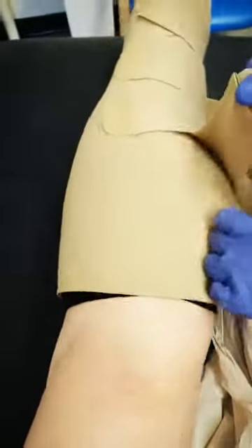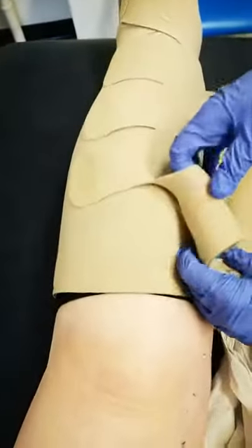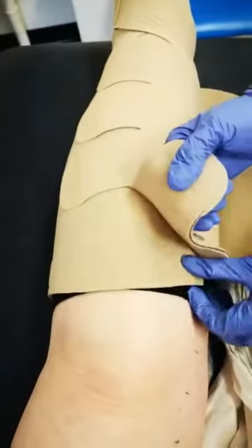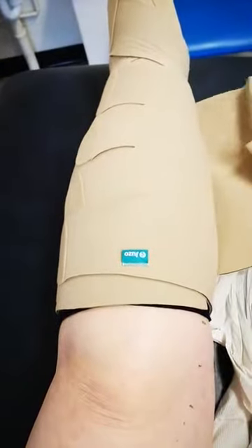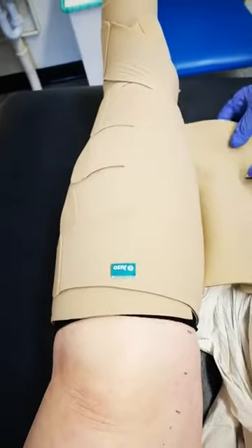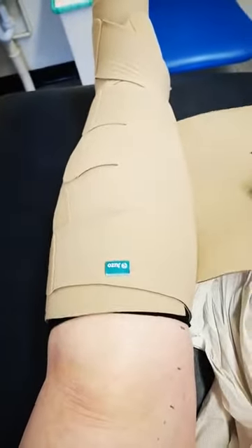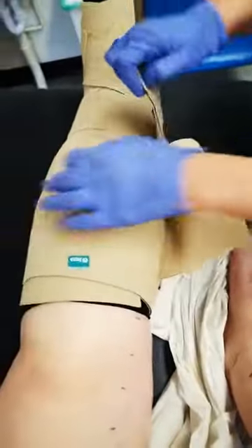And then the same pulling here. This is easier to do than the garment — trying to get the garment on is really difficult. The good thing is as your swelling reduces it will be tighter and easier to do. So now we've got the second layer, and this goes in between the gaps.